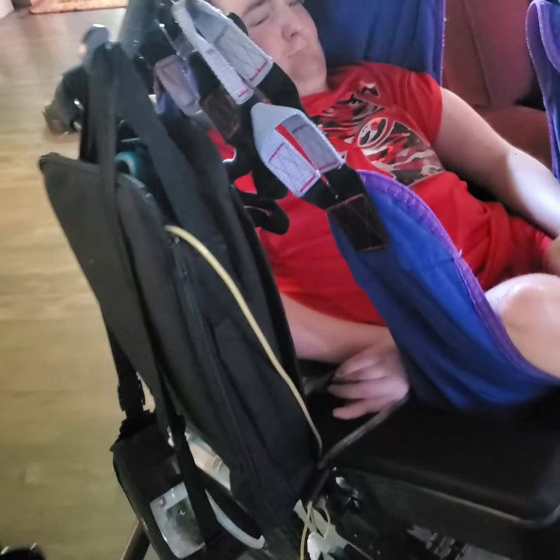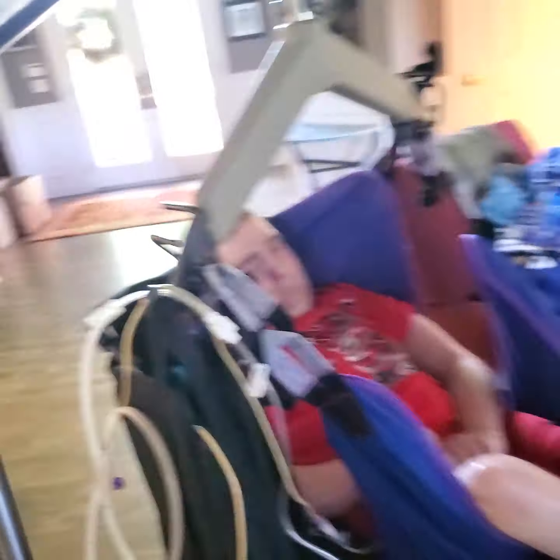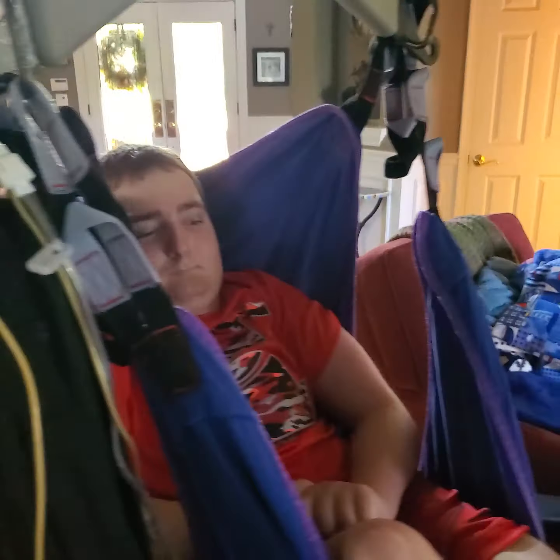Now, as you do this, you want to make sure that all of these tubes are clear and his hand is tucked in, so you don't want these tubes getting caught on anything. Sometimes, if there's enough room, I will just put them up here. And again, make sure that there's nothing there. Also make sure there are no seat belts or anything that is holding him in. So we will continue to lift him up using the handle. It takes me about 20 to 25 pumps to get him where he needs to be.